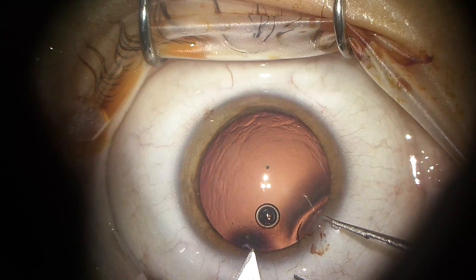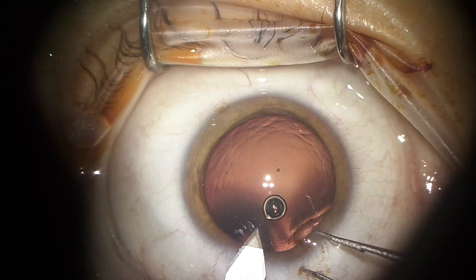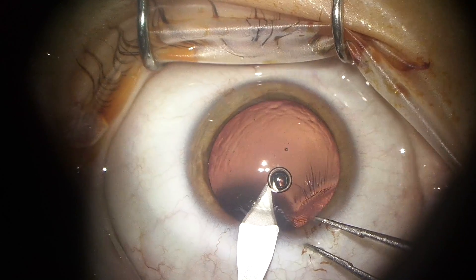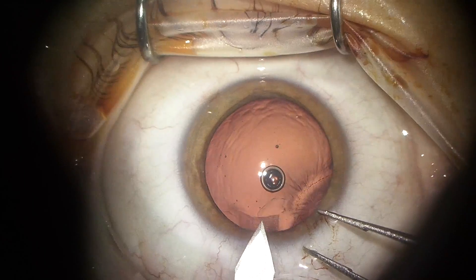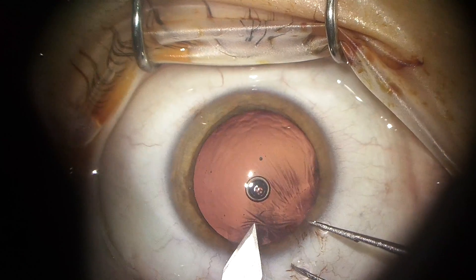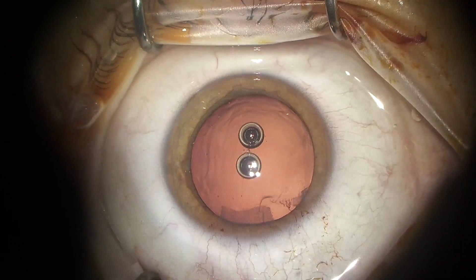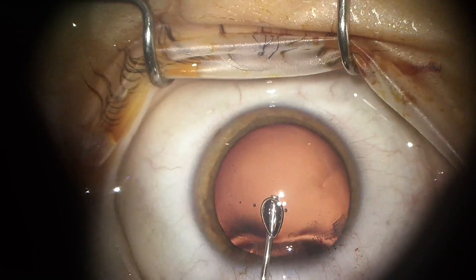I'll go ahead and make a large incision at the top part of the eye. This incision will be about three millimeters in size. As you can see, sometimes there are bubbles within our syringes. Once the incision is complete and widened just a hair on either side, I'll use the jelly substance to push the bubble out of the anterior chamber. I tried it once and there was a bubble in that syringe, so I went ahead and used a different syringe.